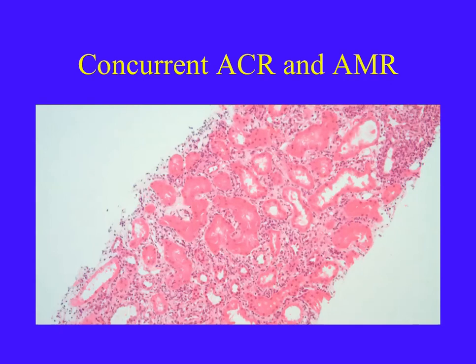When immunoperoxidase studies for the C4D antibody were performed, there are foci of strong linear C4D deposition along the inflamed peritubular capillaries, and this was not a localized phenomenon, but other areas with similar features were seen in this antibody-mediated rejection case. You need to remember that we may have C4D deposition along the bigger vascular components or even the glomerular capillaries in acute humoral rejection.